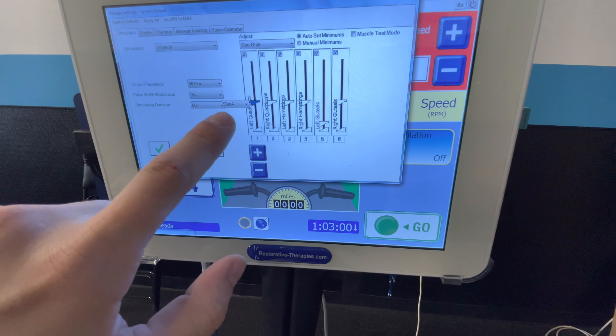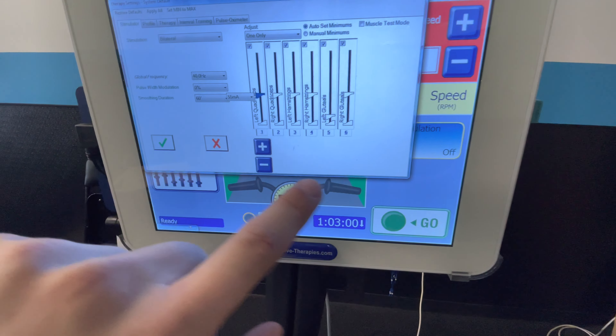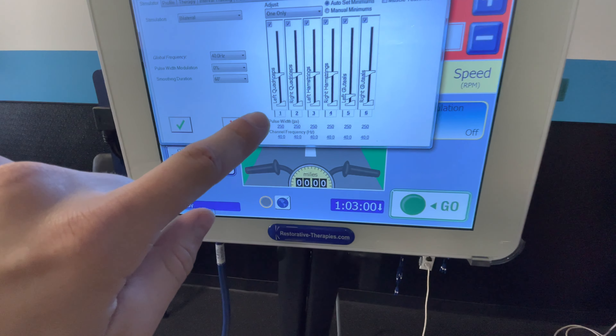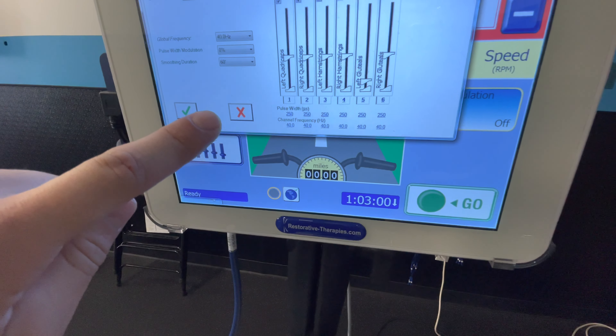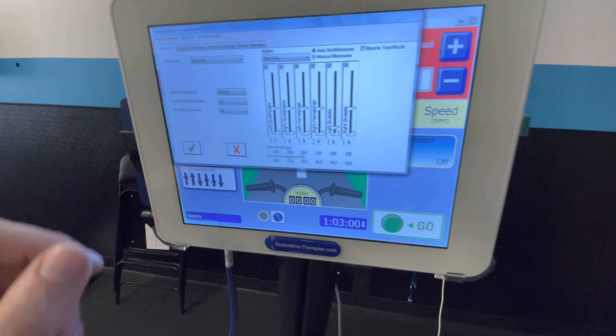Currently one channel is set at 55 milliamps; they scale up to 140 milliamps at the top. Another essential parameter is pulse width, which is able to elicit a wider spread, contracting more motor units and getting a wider contraction for the individual.